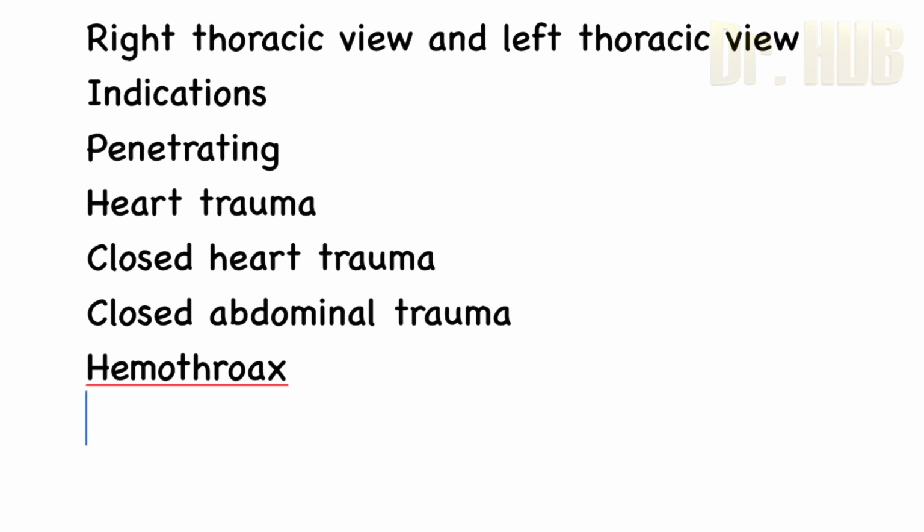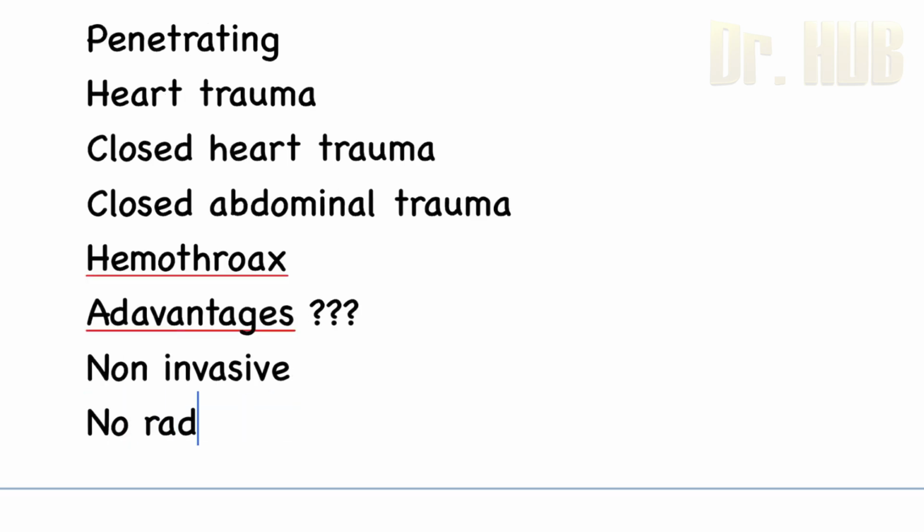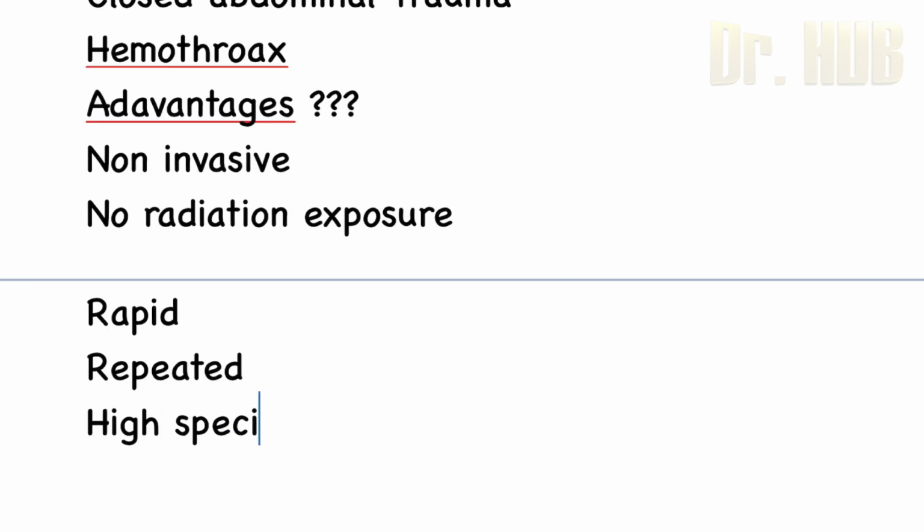So what is the advantage of this? The advantage of the E-FAST is that it is non-invasive. There is no radiation exposure. It is quite rapid. It is portable. It may be repeated, and it has a very high specificity.